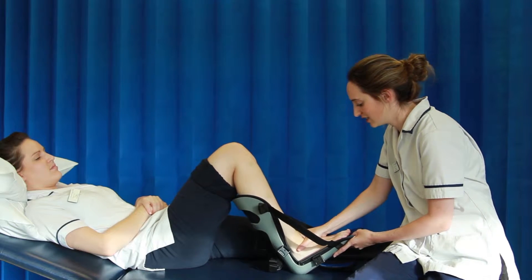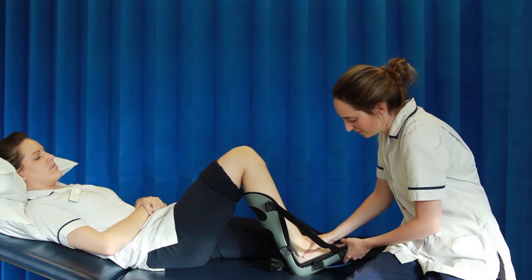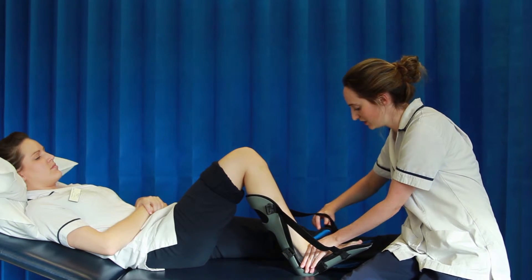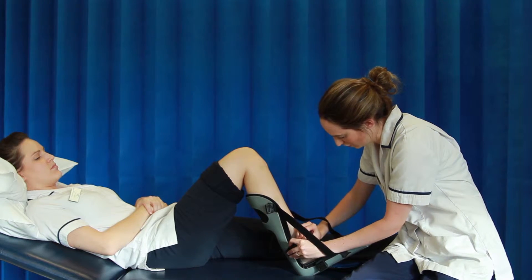Place the foot into the splint, making sure that the heel is making good contact with the splint. Hold firmly, and at this point a strap can then be secured over the top of the foot to hold it in place.